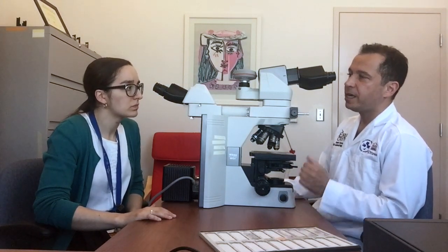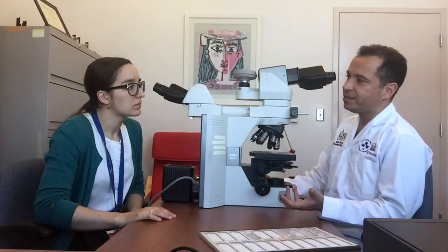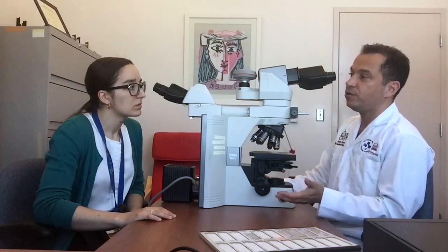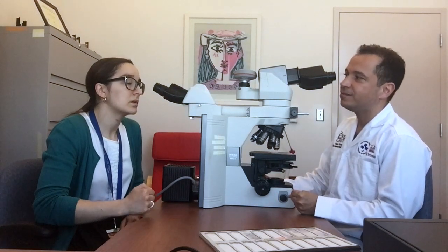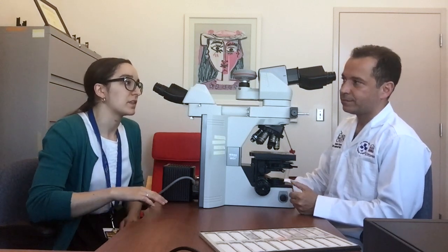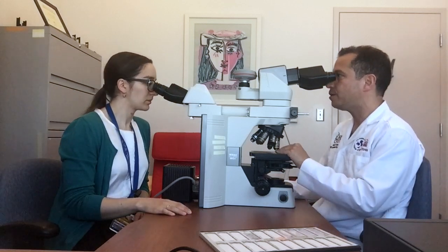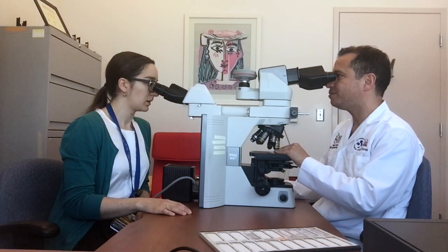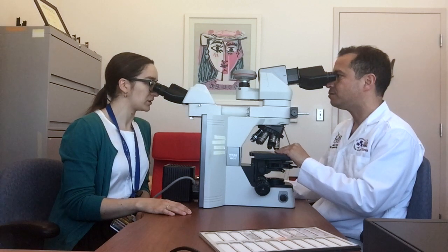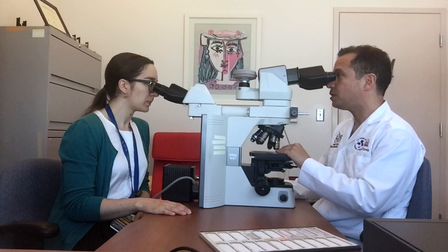Okay, and it's very important to get information because it changes your pretest probability, and it's going to help you define what immunohistochemistry you're going to do. Okay, so it sort of helps direct my management of this case if I think it's a colon primary versus a lung primary. Exactly. Okay. So that's good. So how should we proceed here? So I think I need to do a little bit more work on this patient's clinical and radiologic history. So maybe I'll take the case back and look into that and get back to you. Okay, that's great. I agree with the plan.